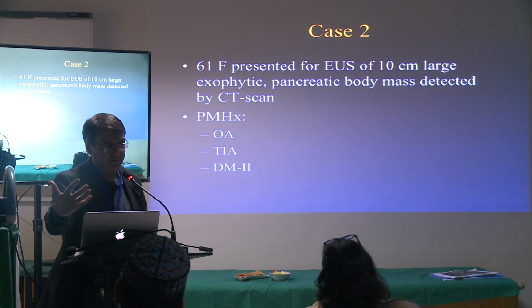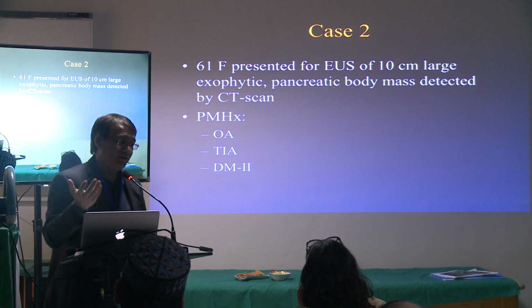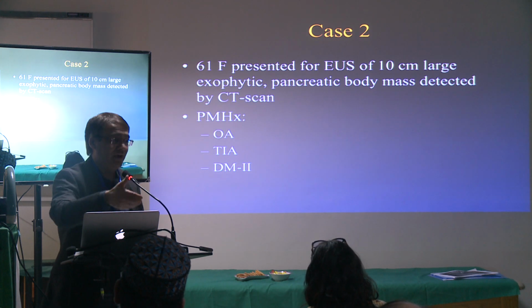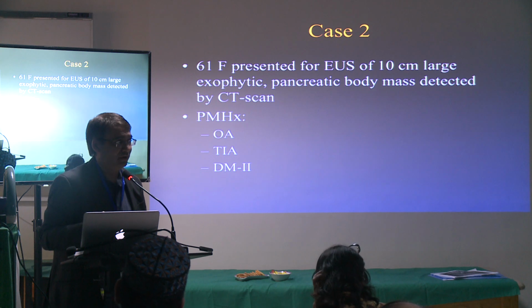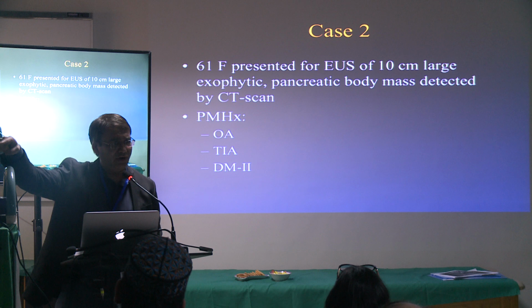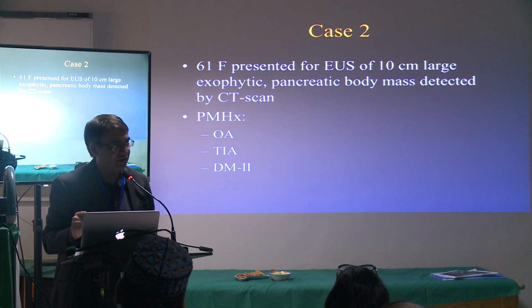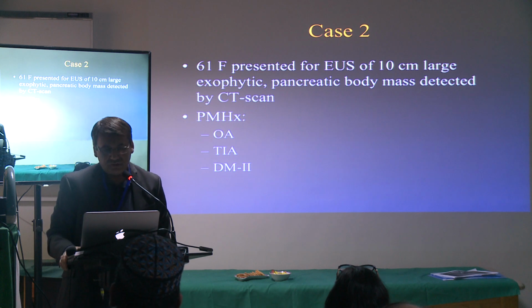Good. What about if the specimen that we are taking from the area is low-grade and we miss the high-grade from another area of the tumor? Well, that's why you have an EUS and you target it properly. We can go over and over and over. We will never end. But that's why you have an EUS. You need to target the right place. Let's move on to the next one.